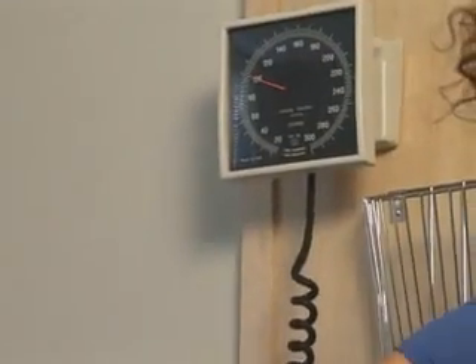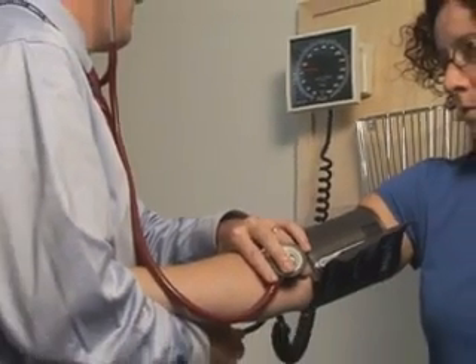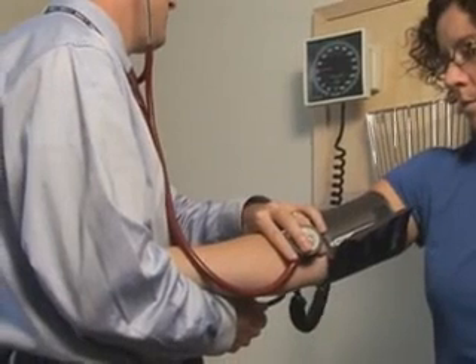The purpose of this video is to demonstrate the appropriate technique for the indirect measurement of blood pressure in adults. Blood pressure should be assessed at each office visit.